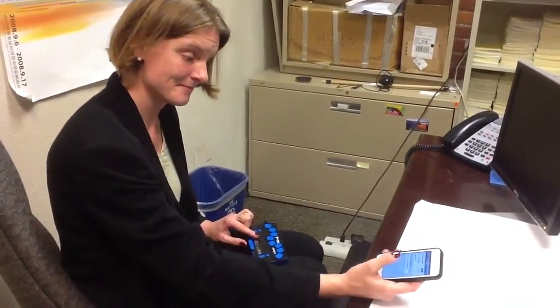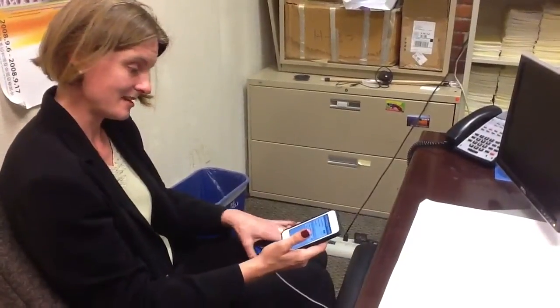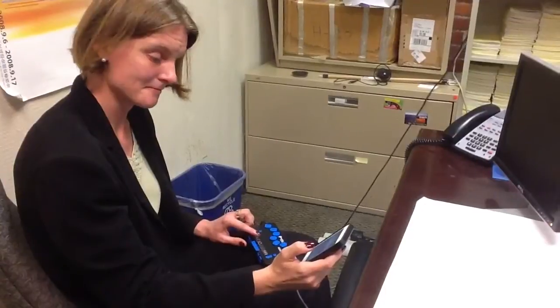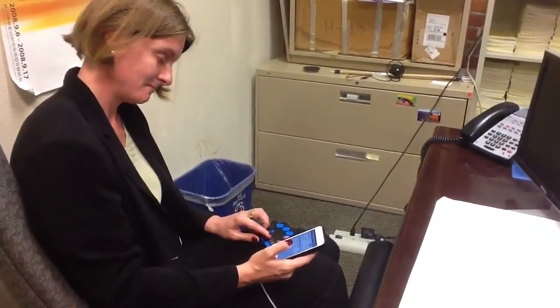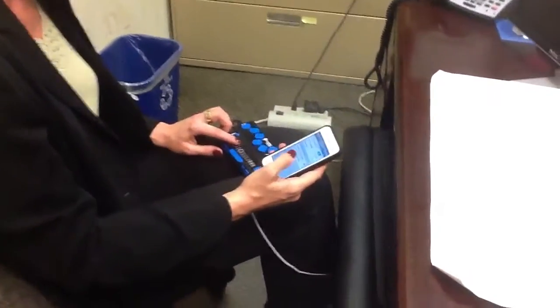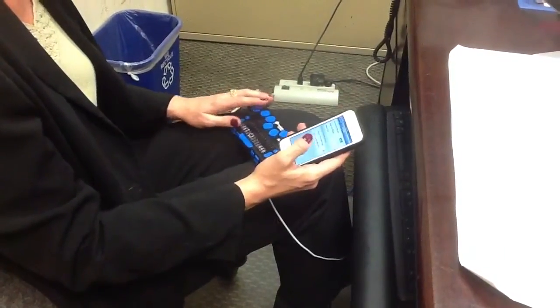It might ask me for a code here in a second. Oh! It says no. I'll try it again. Choose a Braille device — Focus 14 — In progress. Selected. Focus 14 — Connecting. Actually, the pairing is pretty quick usually. It shows Focus 14 — Not paired. Connection unsuccessful. Make sure Focus 14... Of course it's not working when we're doing the video.